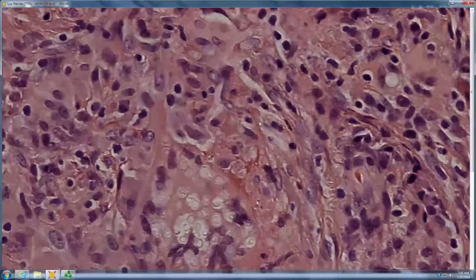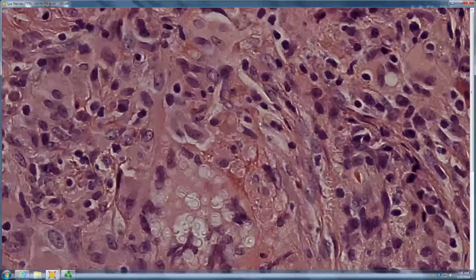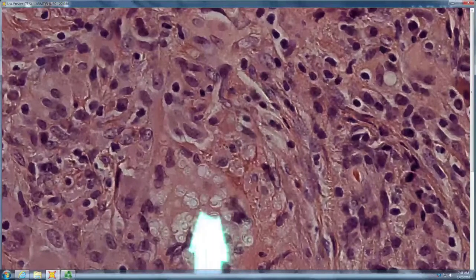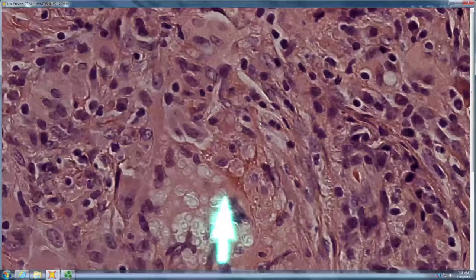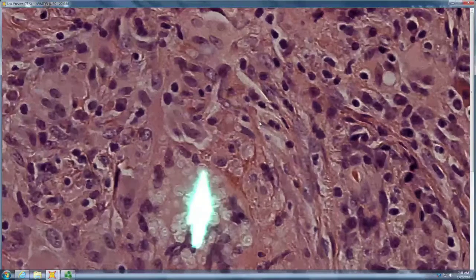So in vessel and in cavitary lung lesion, hyphal for histo. Everywhere else, yeast, and they're tiny little gray dots, no hollow center. This looks like hollow center things, right? And it does have a little capsular space around it, right? That's not a refractile wall. The wall is the thing on the inside, and they're hollow.